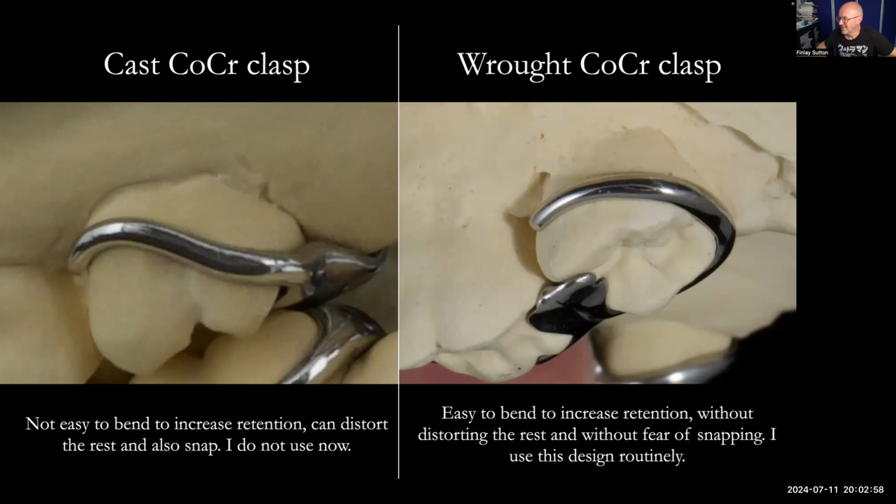Mustafa, for a case like this, would there be any merit in providing a high impact acrylic denture to test the OVD intolerance? Perhaps I'm speaking from hospital perspective where this is easier. In practice, not cost effective. So Mustafa, definitely you could do that, and I could have done that with him. But seriously, what I found, and this is really borne out in the literature too, is that increasing a patient's OVD is just absolutely fine, and patients get used to that without any difficulty.